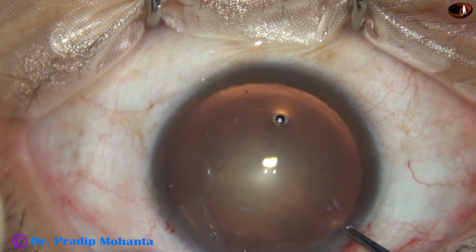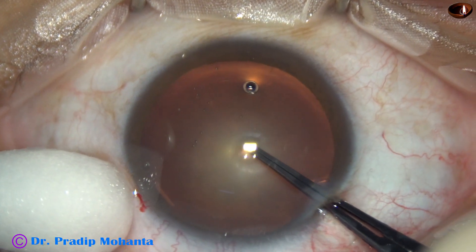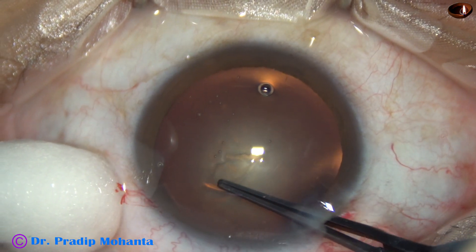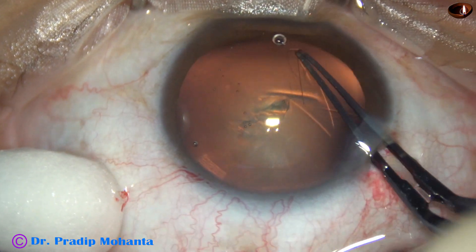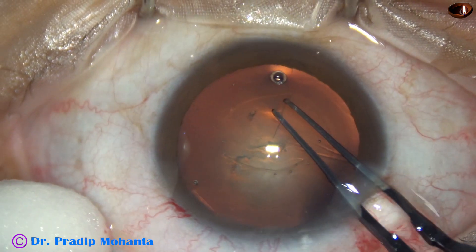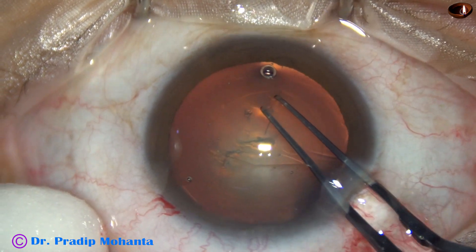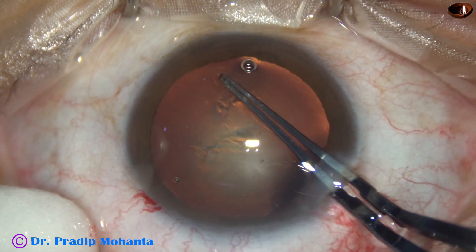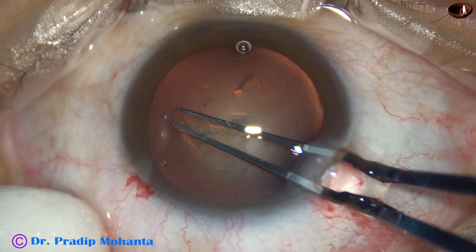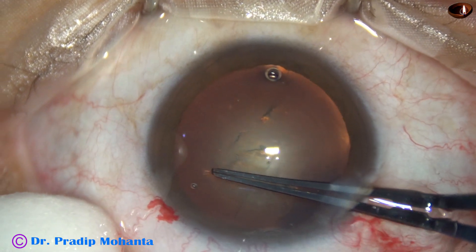And now capsulorhexis is done with the help of utata forceps. The utata forceps makes a puncture at the center of the anterior capsule, and a capsular tag is raised. This capsular tag is rotated all around anti-clockwise to get an adequate size rhexis of about 5.5 mm.